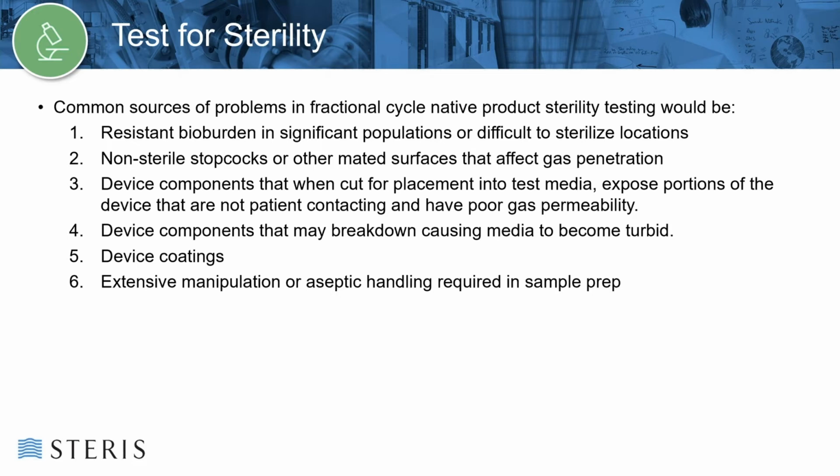Similarly, if the product is a liquid, it may be filtered and the filter immersed in the liquid growth media for a minimum of 14 days. If the extraction method is utilized, extraction efficiency and a risk assessment must be performed.